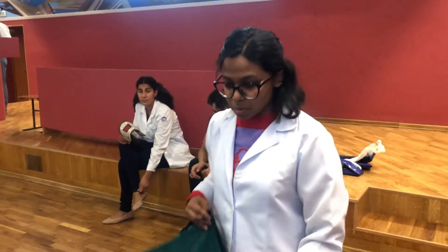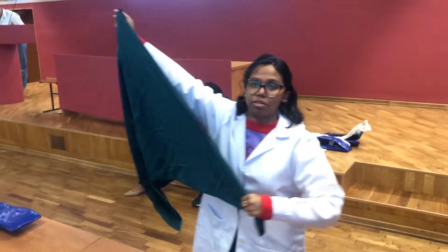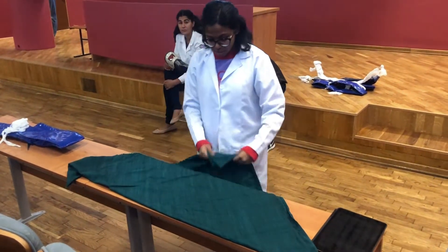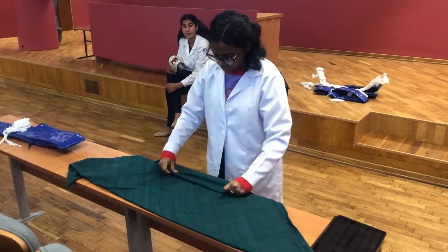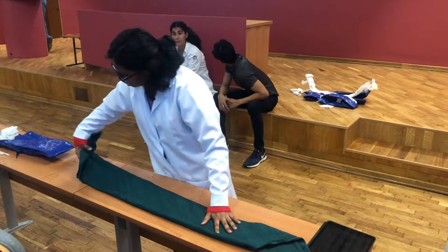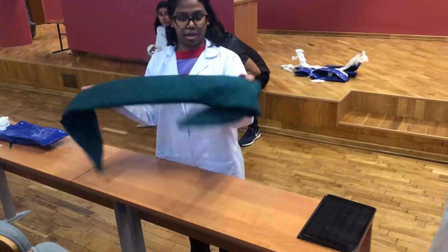Hi, today I'll be explaining how to make a cravat bandage and its uses. First, you'll need a triangular bandage, which is just a square folded into a triangle. Fold it up like that, and this is a cravat bandage.